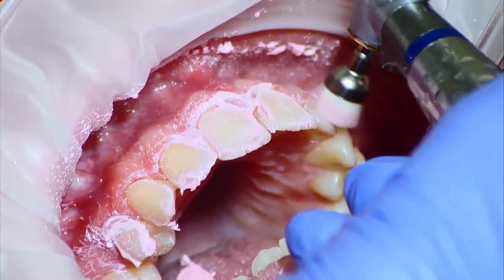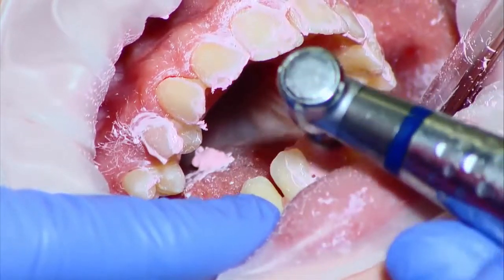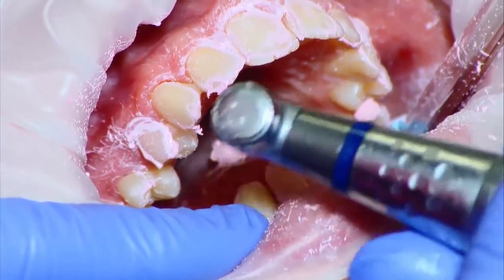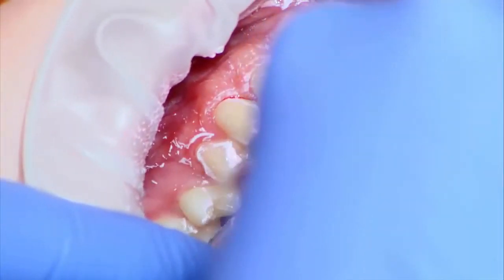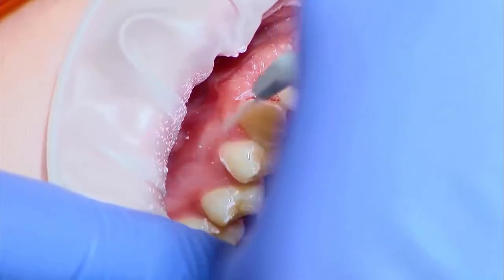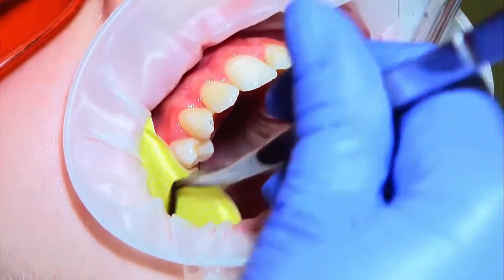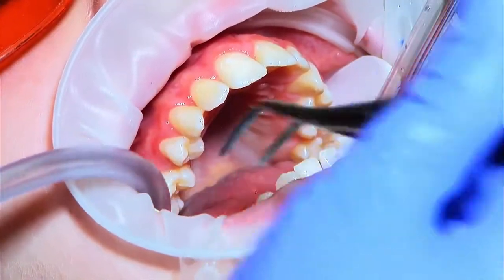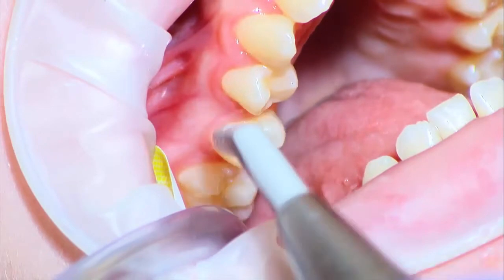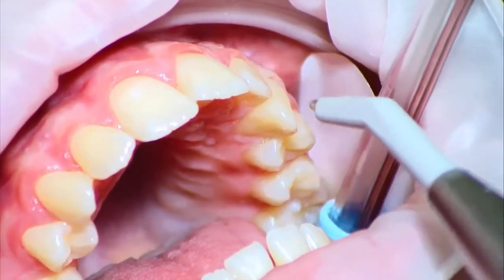Now is the time to call the patient to the chair. Begin to polish the patient's teeth, being careful near the gingiva to prevent bleeding. Then rinse well to remove all polishing agents. Place the dry angles and dry fill system to secure a moisture-free area. Using the air-water syringe, blow air towards the gingiva so that all moisture is off the tooth.